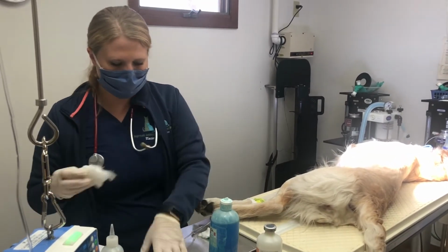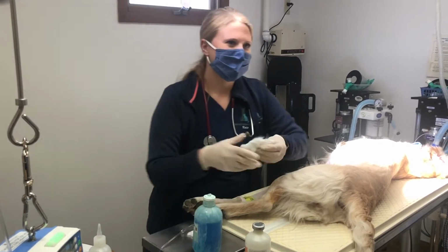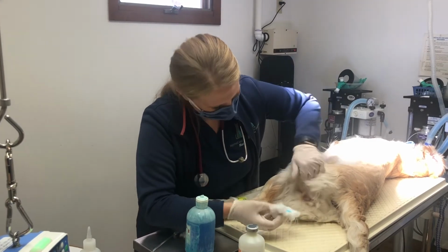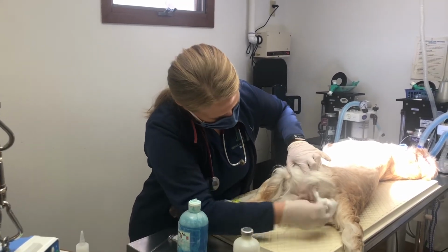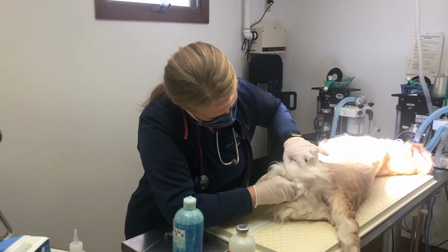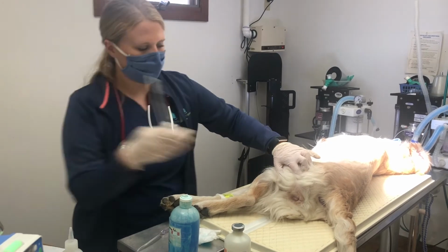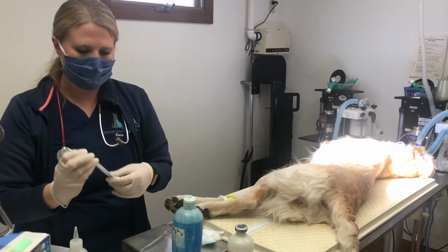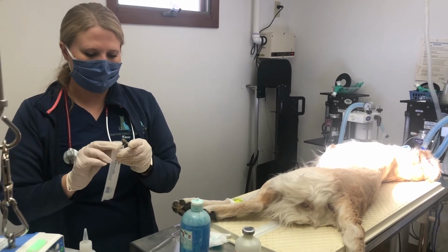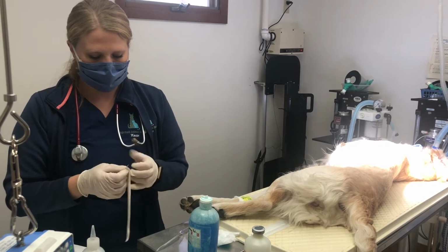Initially, I'm going to clean the vulva. I've got some chlorohex solution. And then I'm making sure that, because she is sedate, the tail will just hang to the side, but otherwise initially you will want to position the tail so that it won't fall forward back onto the sterile field.